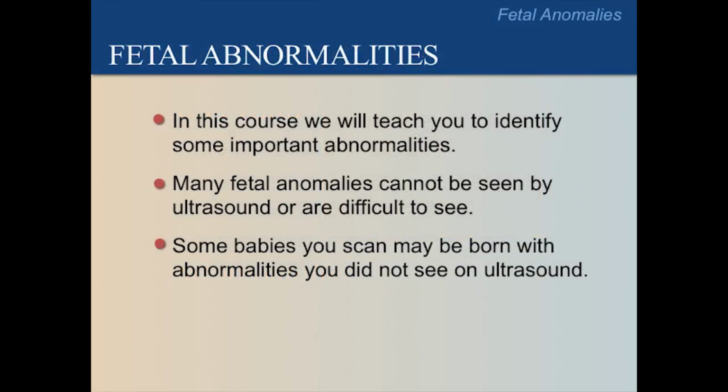We will teach you how to identify some important abnormalities. Many abnormalities cannot be seen by ultrasound or are difficult to see. Therefore, we do not expect you to identify all abnormalities on ultrasound. Some babies you scan may be born with abnormalities that you did not see on ultrasound. This does not mean you made a mistake.